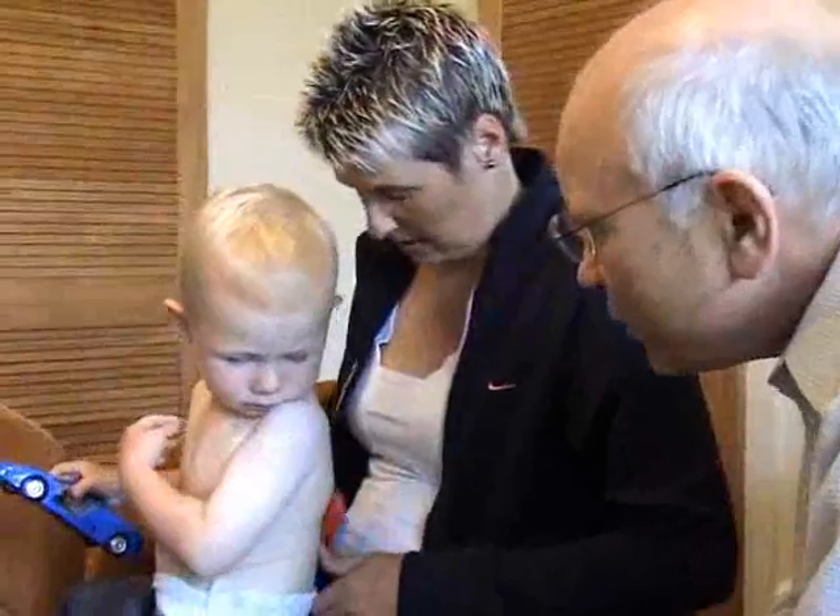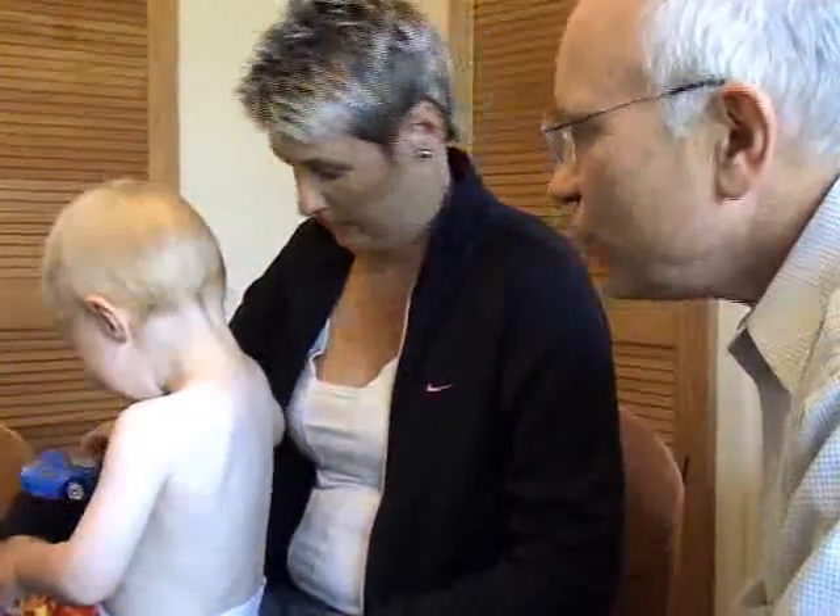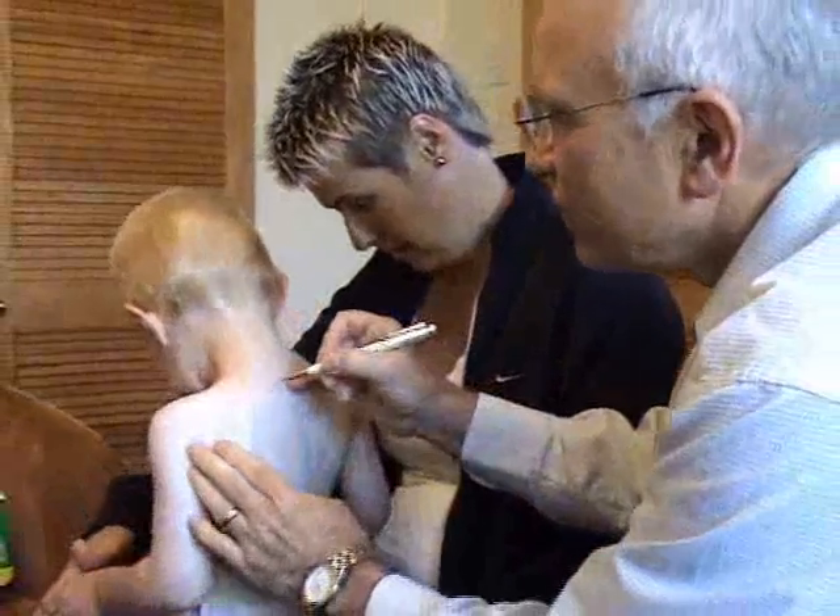Hi Josh, we're going to do some skin tests on you. The first thing I'm going to do is draw on your back. Okay Josh, we're going to do some little drawings.